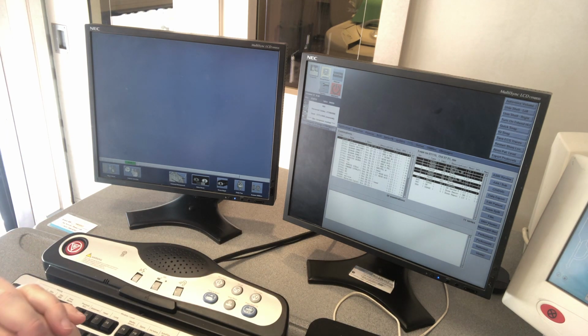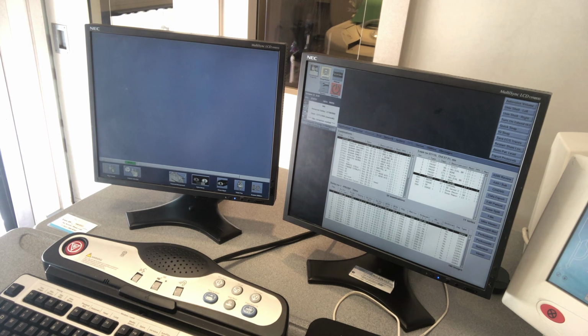And the sagittals are not there. I did. She did. And it went all the way through again? Yes. So since our sagittals are not showing up, we're going to go back.